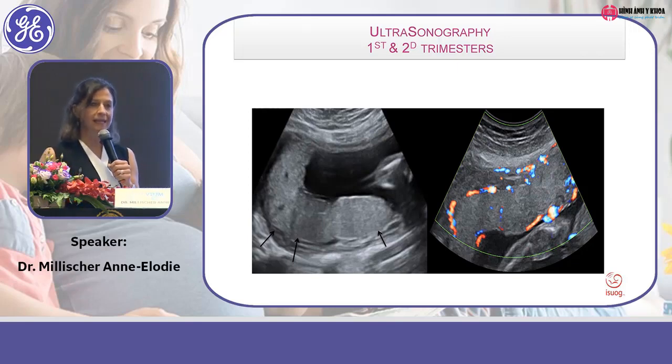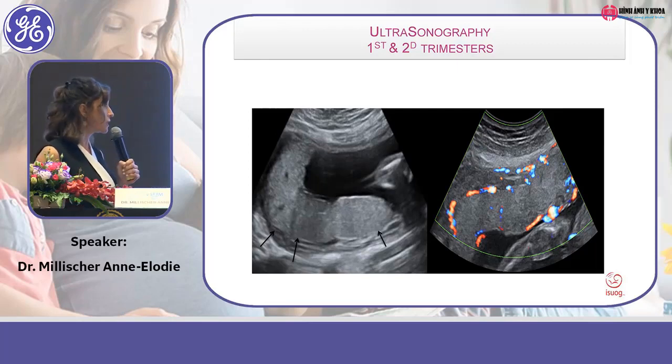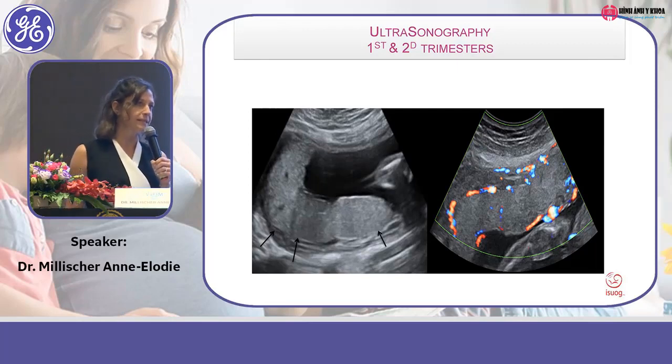And once again, it is very important to explore the placenta by 2D mode and Doppler systematically.